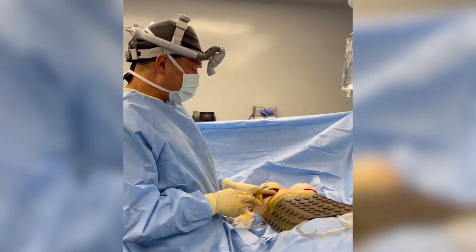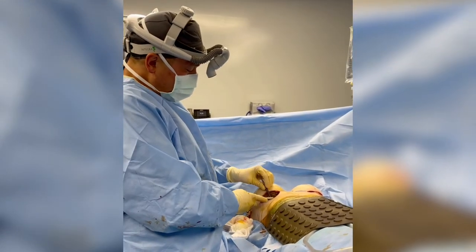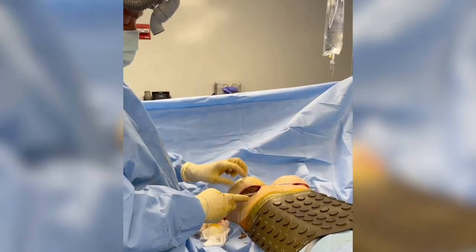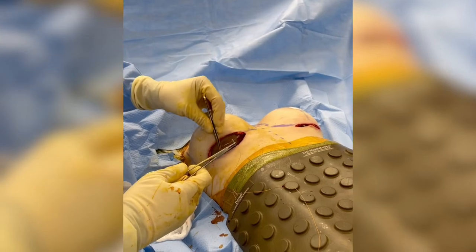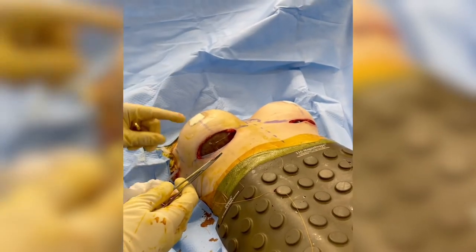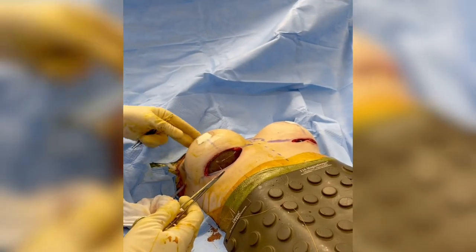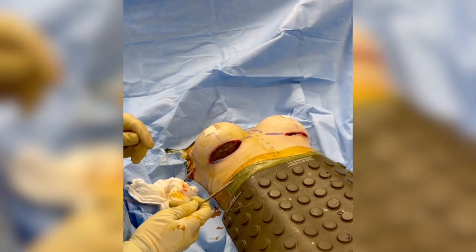I've got my Galliflex-wrapped implant into my pocket. I've sewn it to the chest wall, so this construct is secure — it's not going anywhere. I leave a drainage tube between the mesh and the skin to avoid any seromas or fluid accumulations. You see how beautiful her breast looks. You see the cleavage. It's amazing. She's going to love this. I think it's going to be awesome.